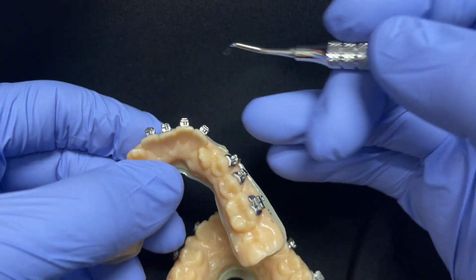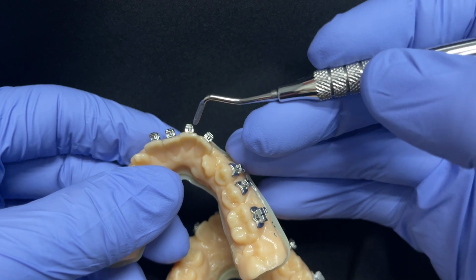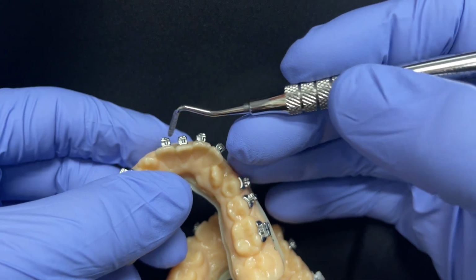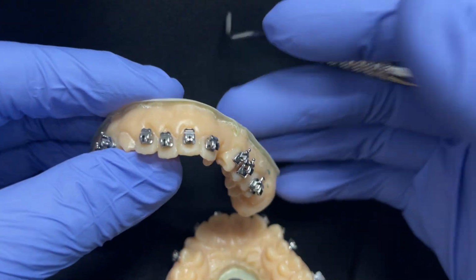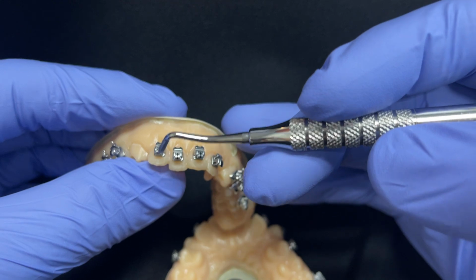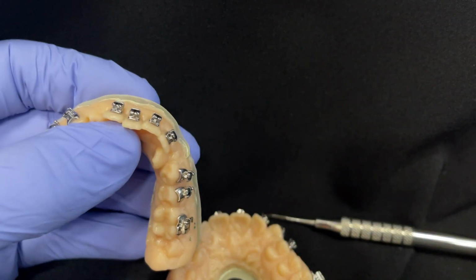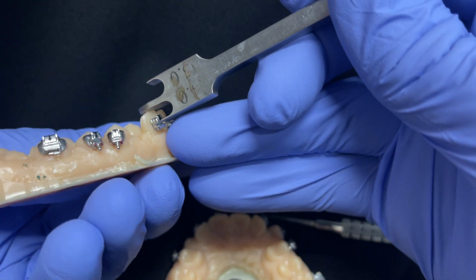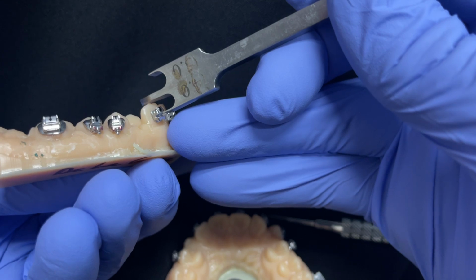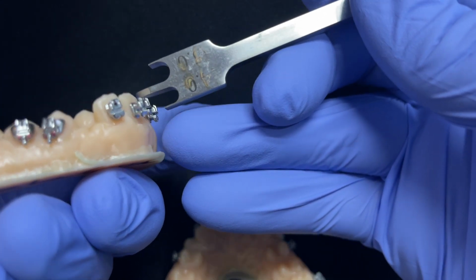As I mentioned before, I really like to cheat my laterals a little bit to the mesial. Central's right on the money in the center. And then once again, cheat the lateral a little bit to the mesial. Average bracket position here, I'd say, is around 4 millimeters. Let's just for fun see where it ended up here. And look at that, right at 4 millimeters. So 4, 4, 4, and 4.